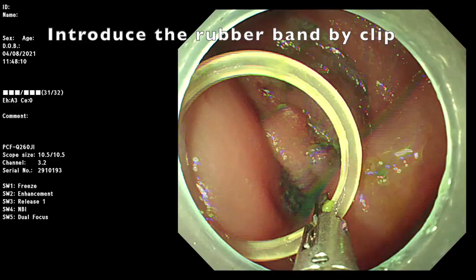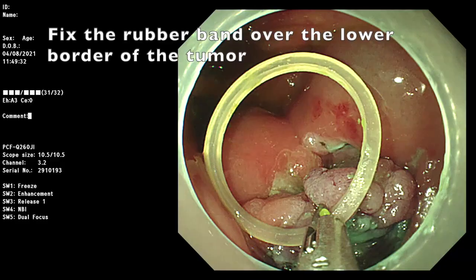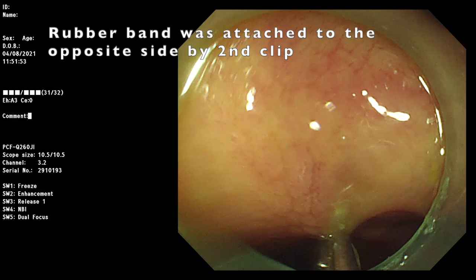The rubber band was introduced by the clip. Then, the rubber band was fixed on the lower border of the lesion by the same clip. The rubber band was then attached to the opposite side of the colonic wall by a second clip.